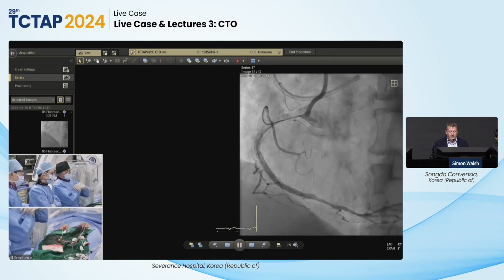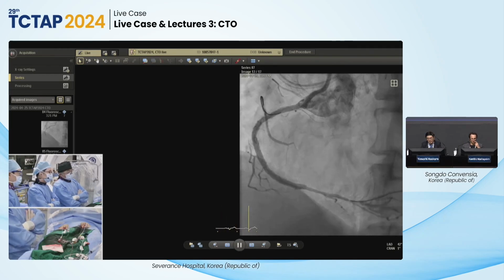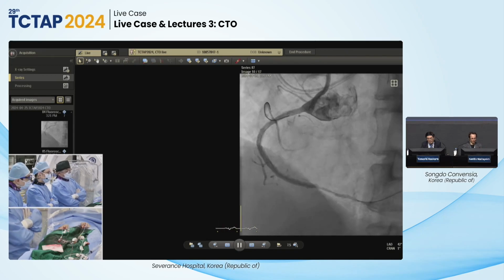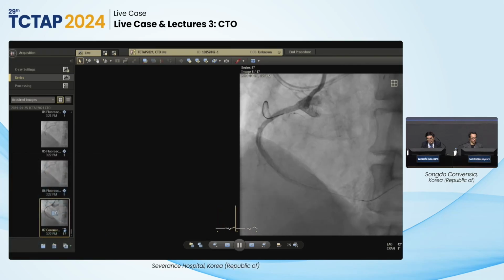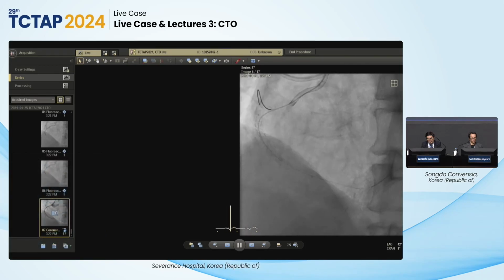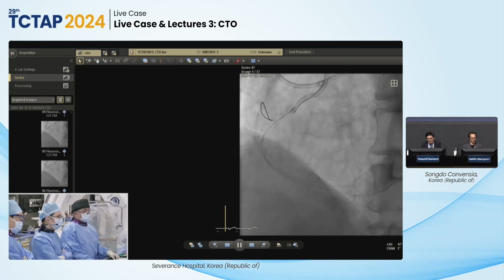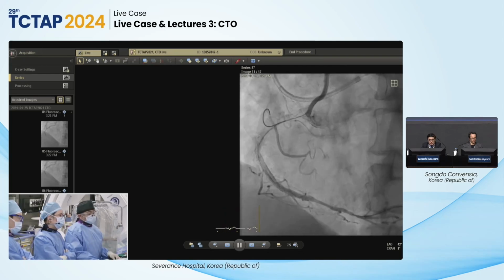So okay, this is the implant of the mid RCA stenting with the 3.0. Already, I did not want distal edge damage. So the distal portion was under-expanded, at nominal pressure, and then I increased the pressure up to 16.